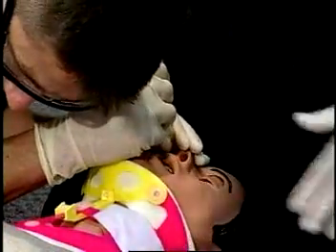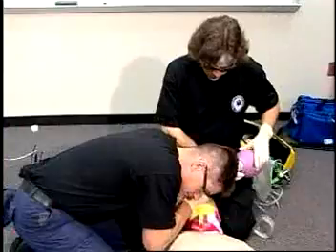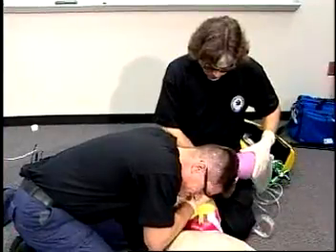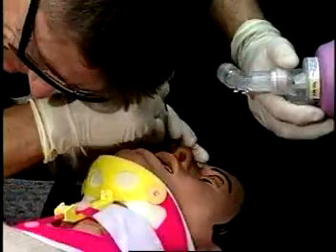Slight back and forth rotation of the tube may be useful in aiding passage through the posterior nostril into the pharynx.